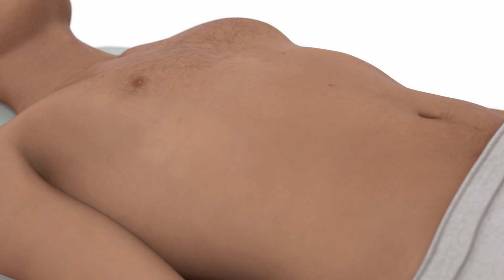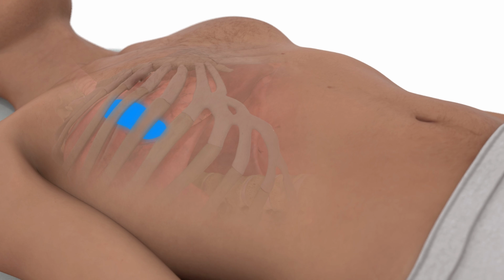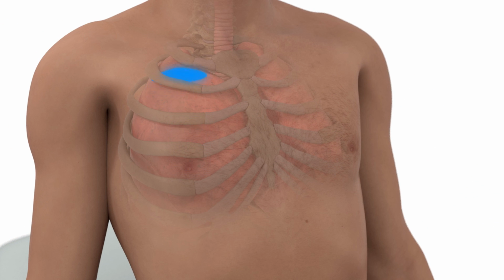When assessing for pneumothorax, the patient should be in the supine position so that air in the thoracic cavity will preferentially collect along the anterior chest wall. If the patient is not supine when examined, free air in the thoracic cavity will collect at the apical region and is more difficult to detect with ultrasound.